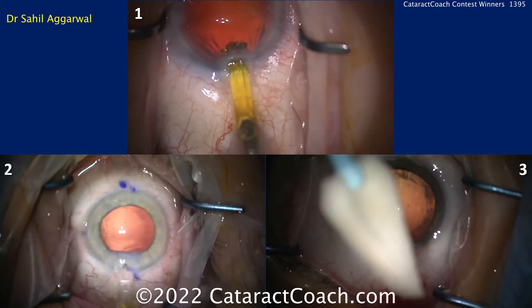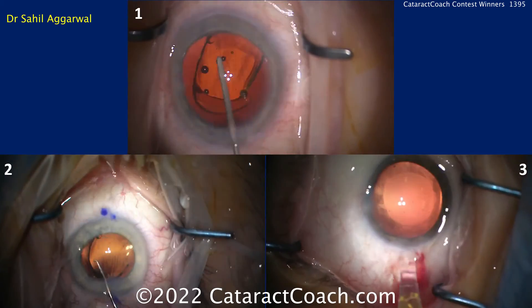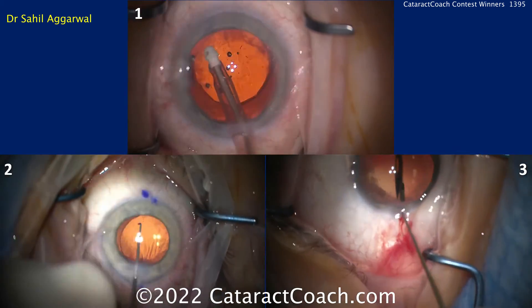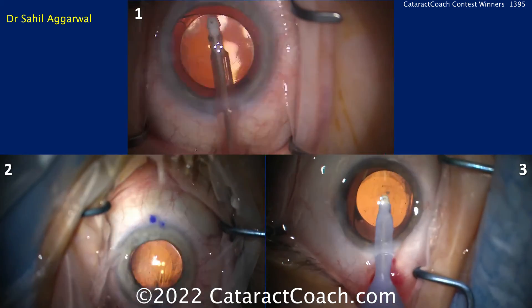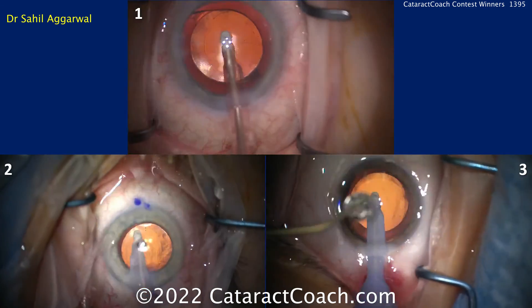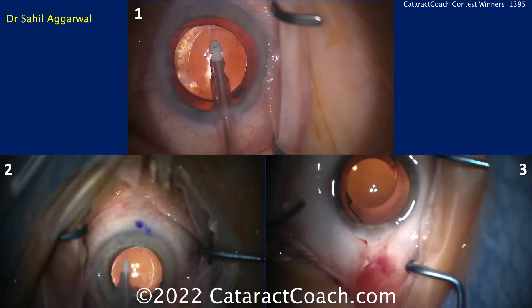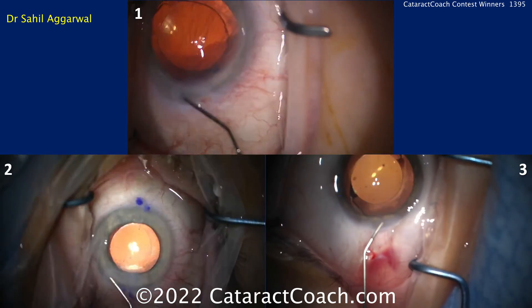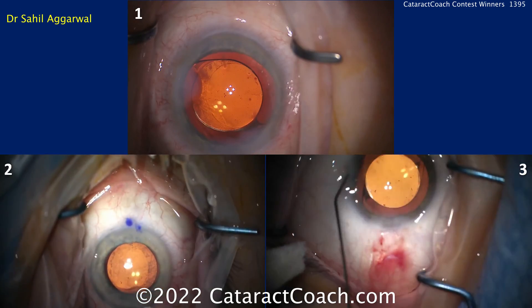Preparing to put the lens in. In panel three I'm having a hard time finding my wound with all the conjunctival ballooning, but eventually I'm able to get the lens in for all three cases. I'm making sure I'm putting the lens in the correct orientation, then doing the final I&A. So what was the case order? Panel one was case 59. Panel two was case 19. And panel three was case 2. Thank you so much.